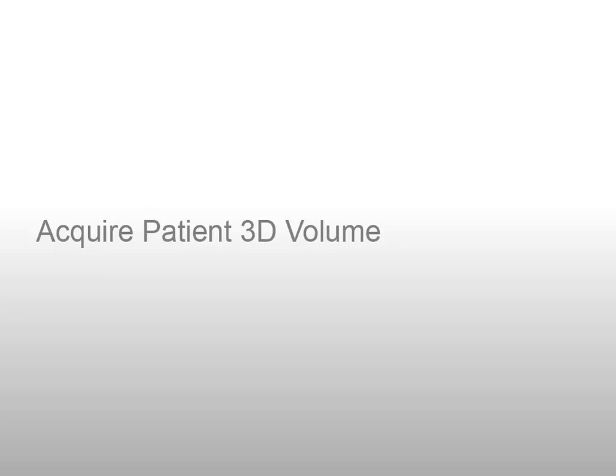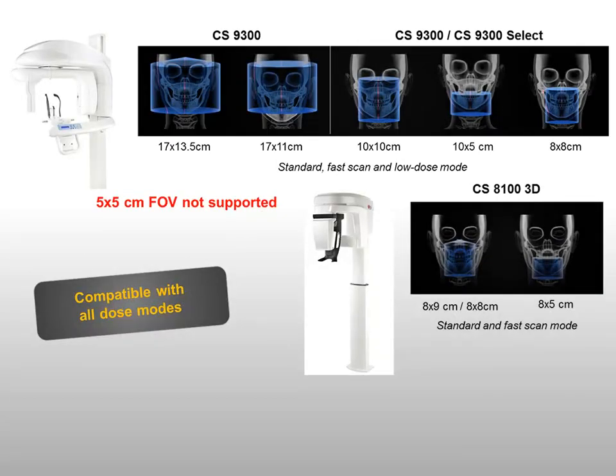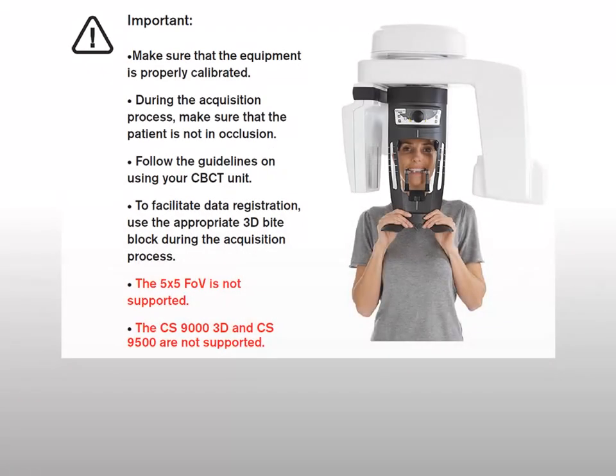Acquire a 3D volume of the region of interest using a CS8100 3D or CS9300 units. These CareStream Dental CBCT units and fields of view are specifically adapted for this use. Be sure to use the appropriate 3D bite block during the X-ray acquisition process. Then perform an evaluation of the region of interest and take the necessary measurements.